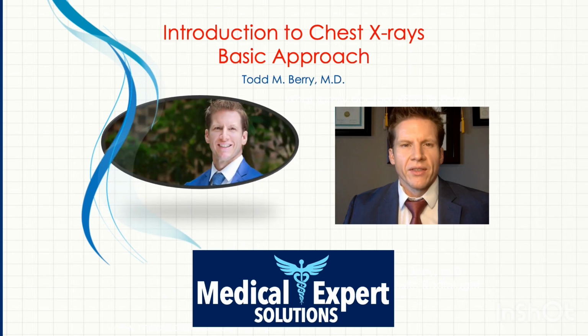Hello, welcome everyone to this introductory video to chest x-rays. This video is designed to give you a solid foundation and systematic approach to interpreting chest x-rays and things that you're going to most commonly see in your clinical practice.